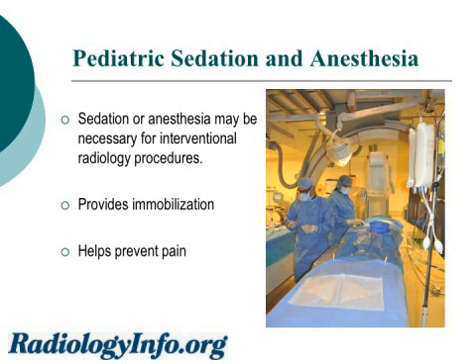Sedation or general anesthesia are usually necessary for children undergoing interventional radiology procedures because they are more invasive and also require that the child hold very still. Shown here are two radiologists preparing to perform an angiogram on a child in the interventional radiology suite. The child is under general anesthesia.